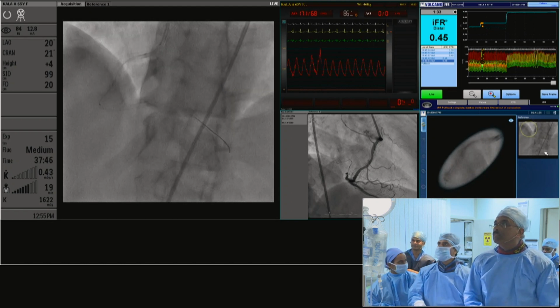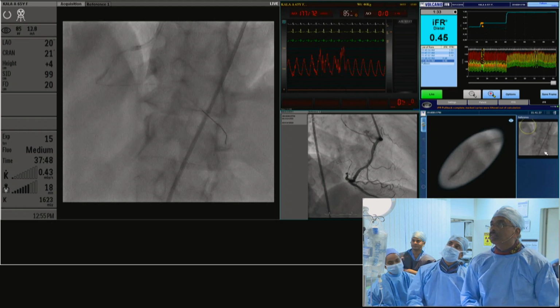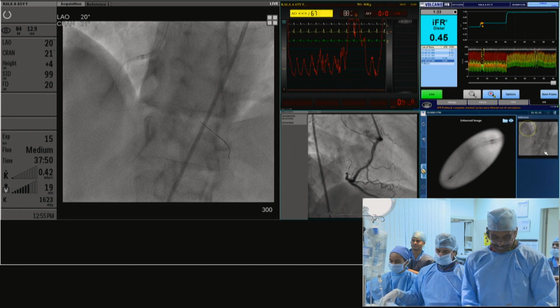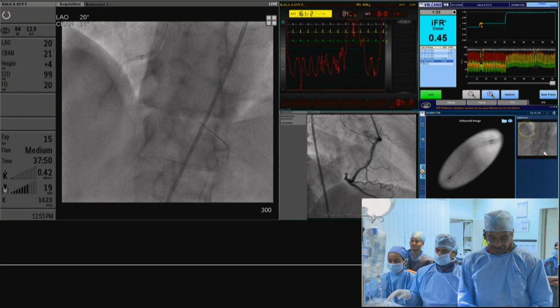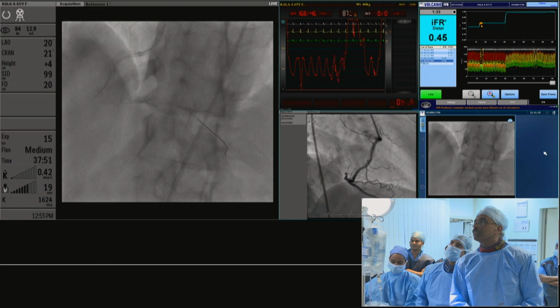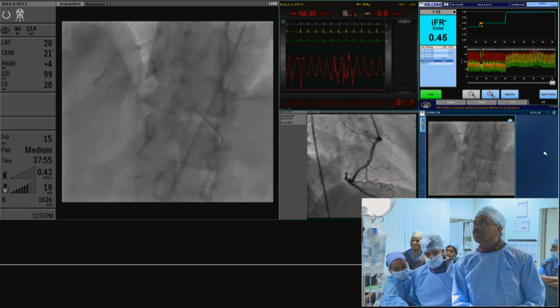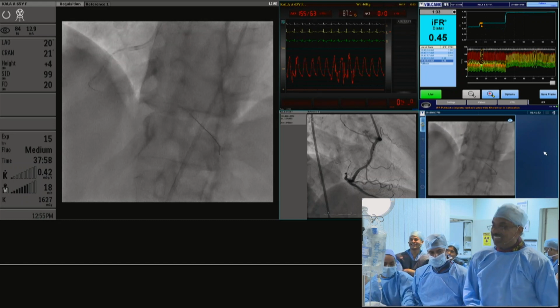The issue, my issue, is that's not the explanation for actually treating the mid and proximal LAD with a 38 millimeter stent. No, I'm just talking about distal treatment. Yeah, with RCA alone. My issue is, in fact, that's the issue that guy raised there. I wasn't even raising it.